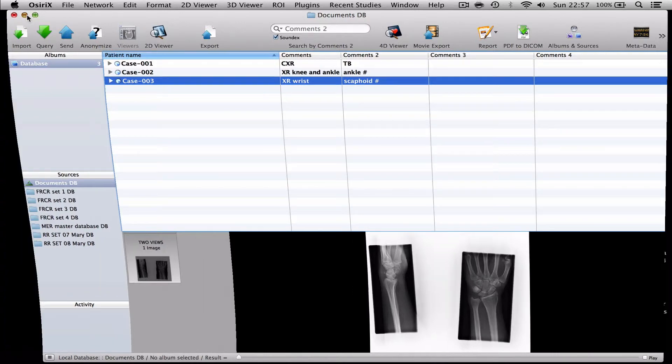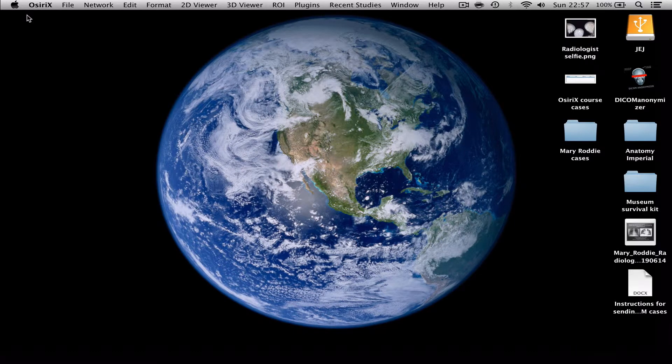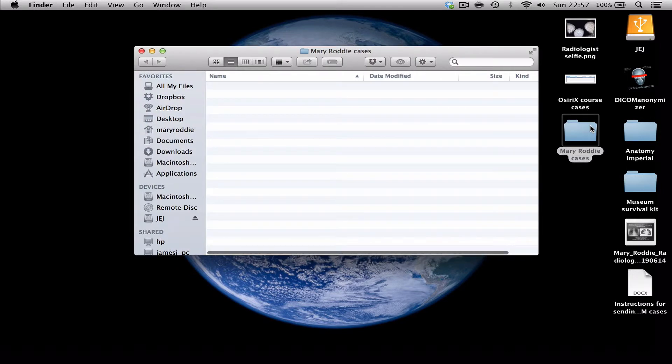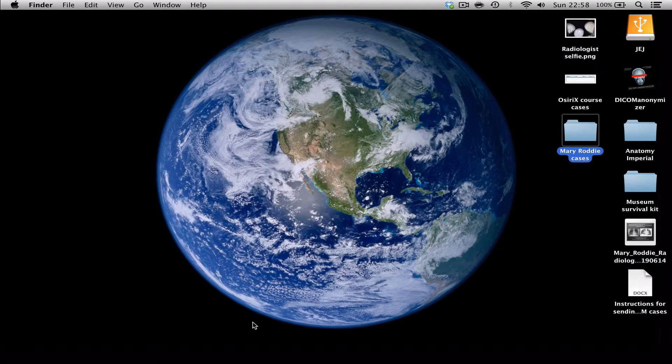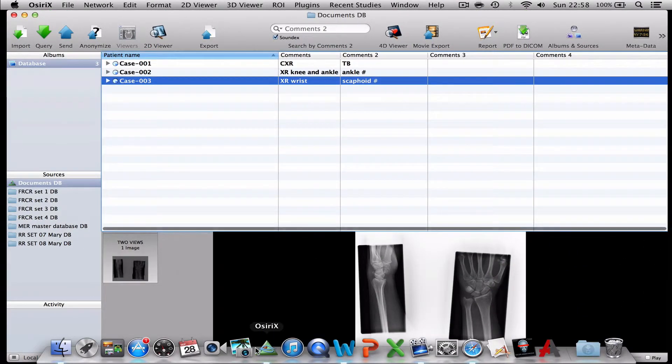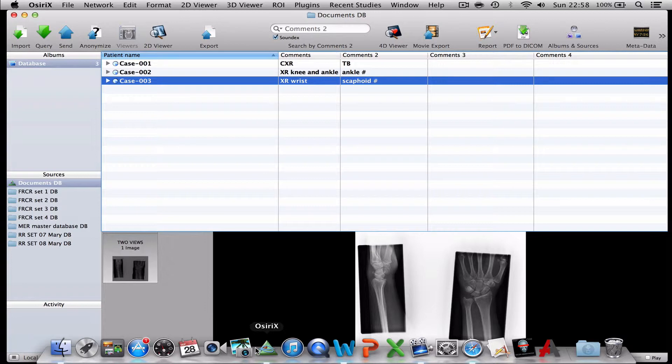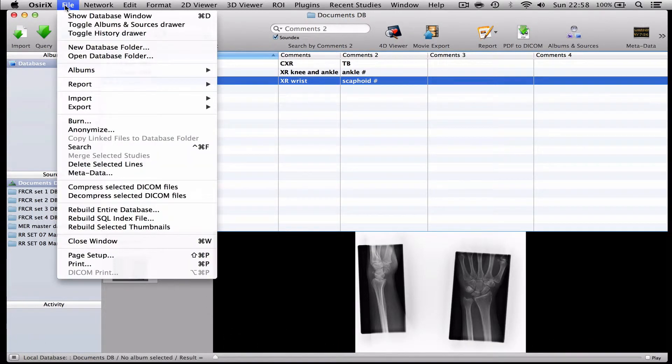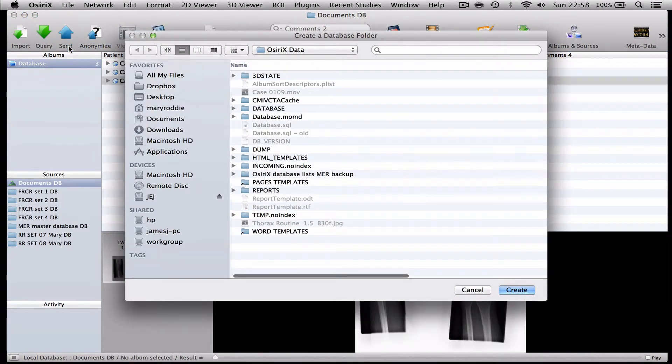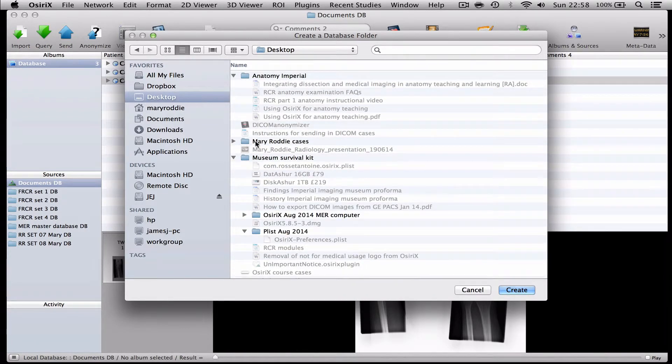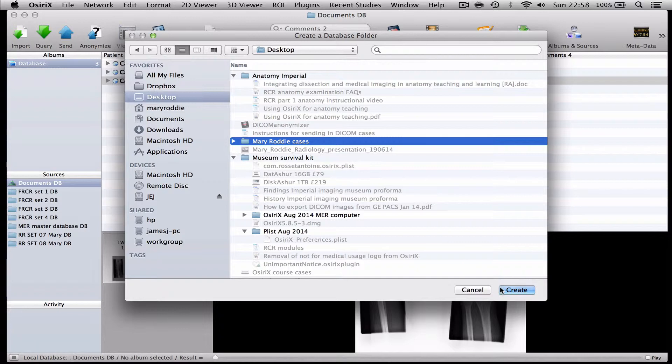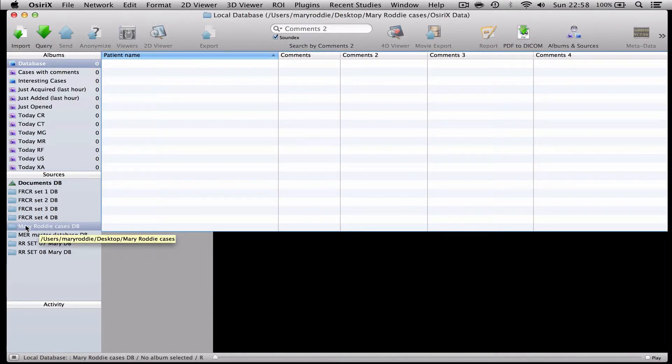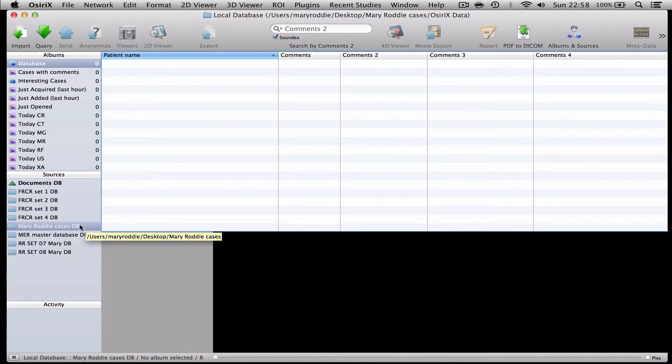So if you remember the way that we do that is we need to first of all create a new folder. And if you look at my desktop you'll see that I've created a folder called Mary Roddy Cases. And if I open up that folder you'll see it's simply an empty computer folder. Now if I open up Osirix again, what I need to do now is to make that into an Osirix database. And the way we do that is to go to File, New Database folder. I'm going to point it at the desktop and to the file called Mary Roddy Cases and press Create. And now I have an empty database here called Mary Roddy Cases.